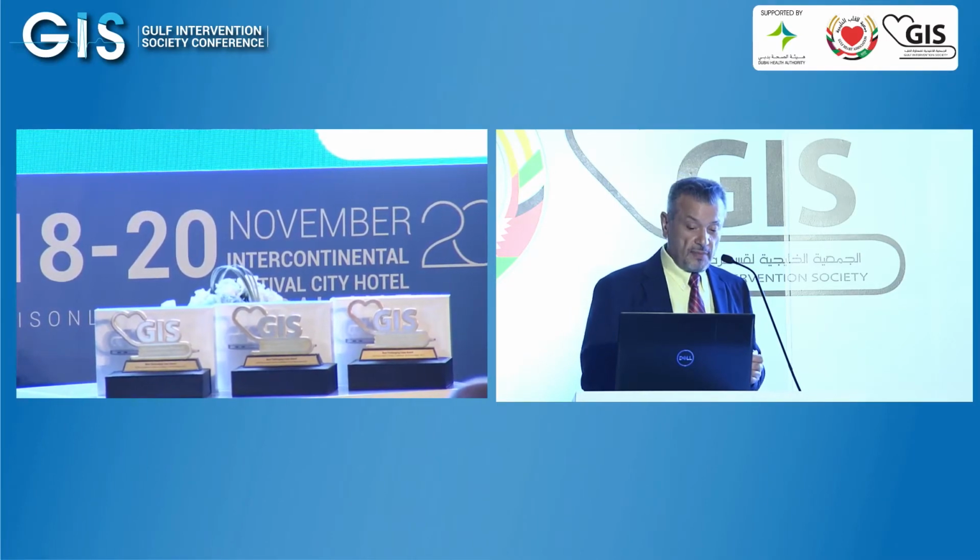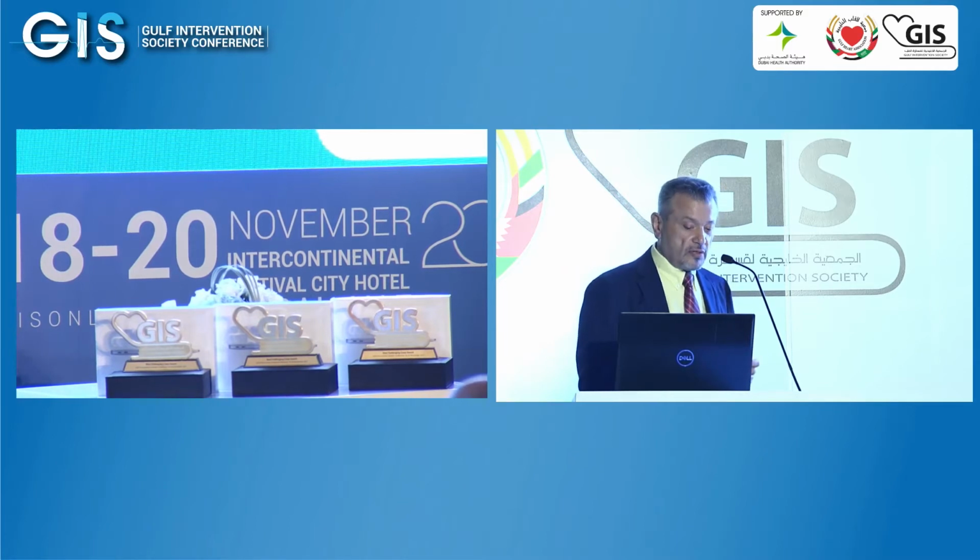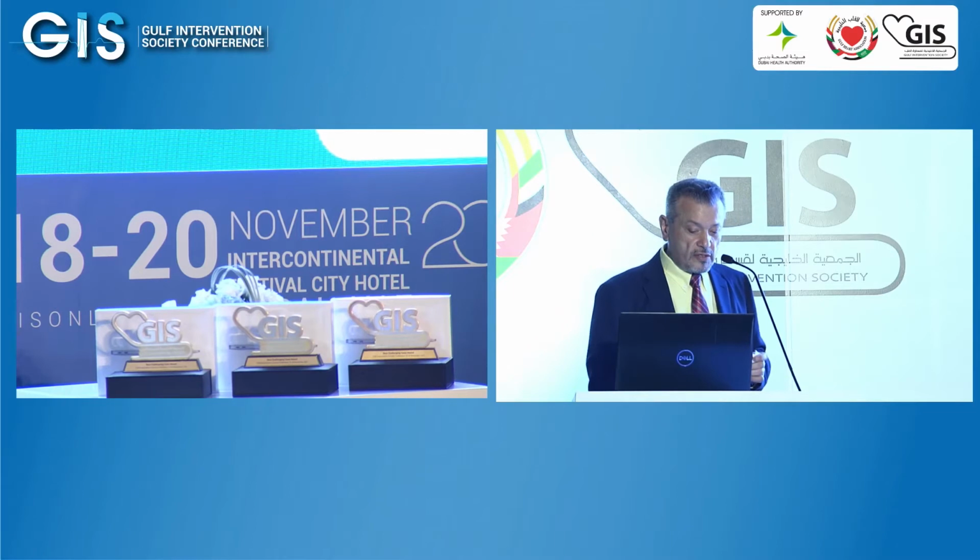But the patient did not feel well and continued to have chest pain, knowing that he also had uncontrolled diabetes. He's somewhat non-compliant, also hypertensive and dyslipidemic. I did the dobutamine stress echo, although I did not have to, only to convince the insurance that we have to do him. Otherwise, the insurance would not have approved. His echo was normal. ECG showed some T-wave changes and septal Q waves.